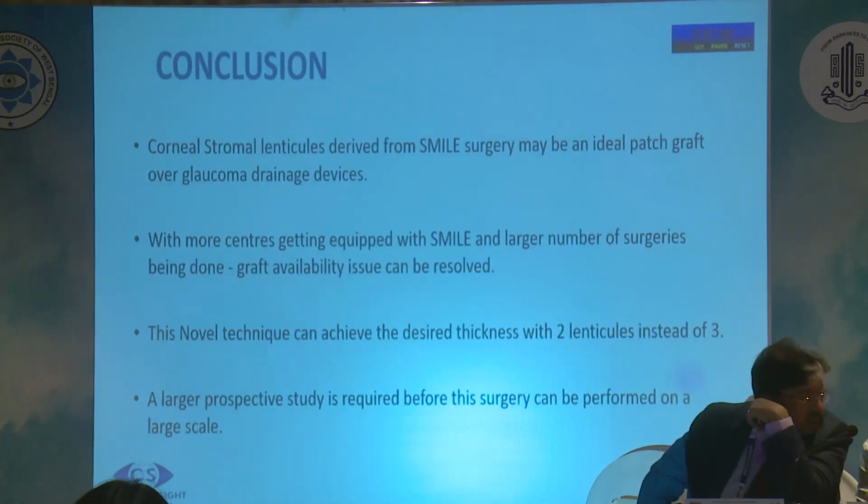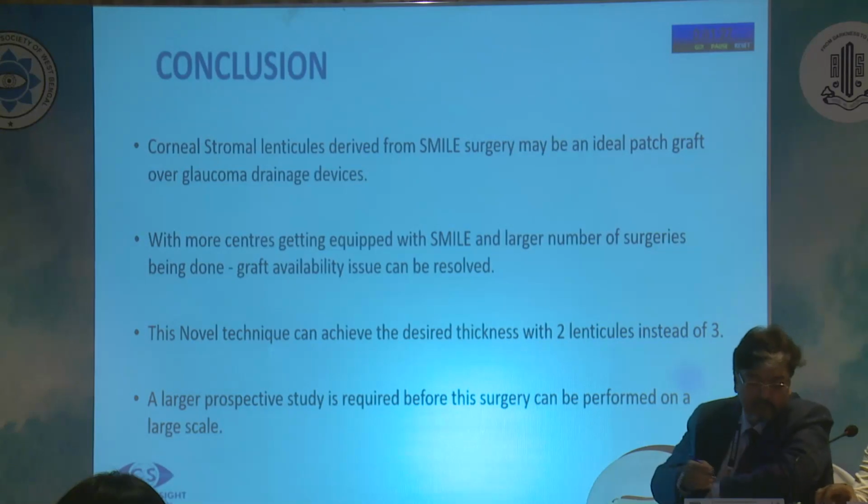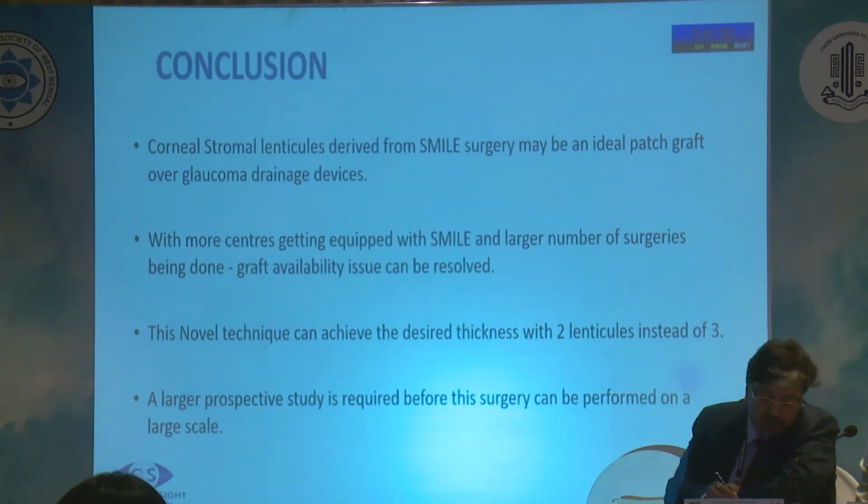To conclude, corneal stromal lenticules derived from SMILE surgery may be an ideal patch graft over glaucoma drainage devices. With more lenticule extractions being performed, the graft availability issue can be resolved. This is a novel technique, and a larger prospective study is required before this technique can be performed on a large scale.